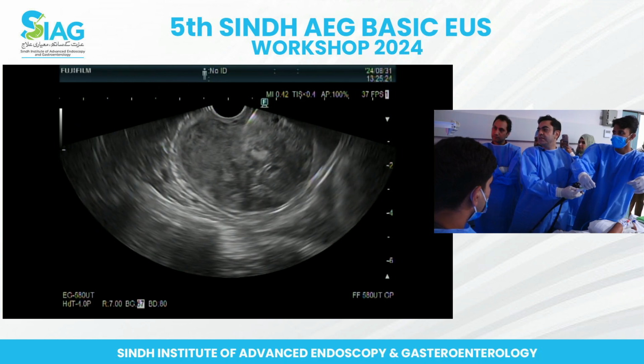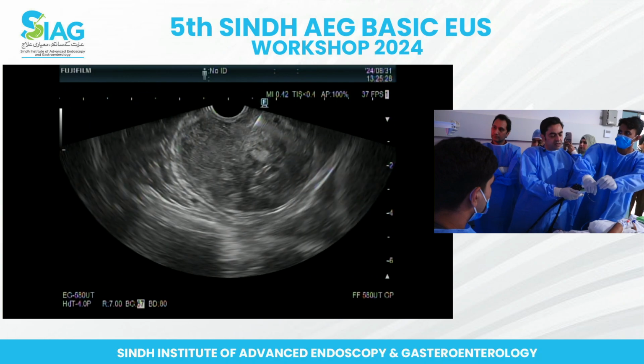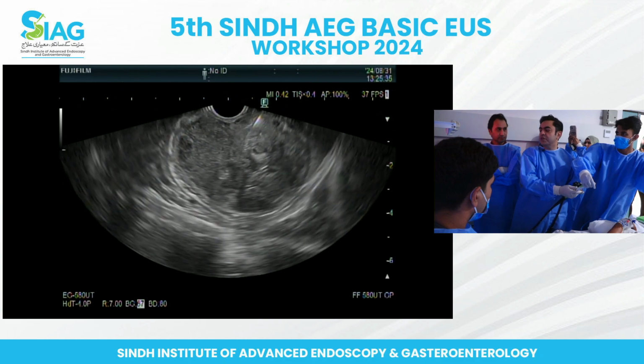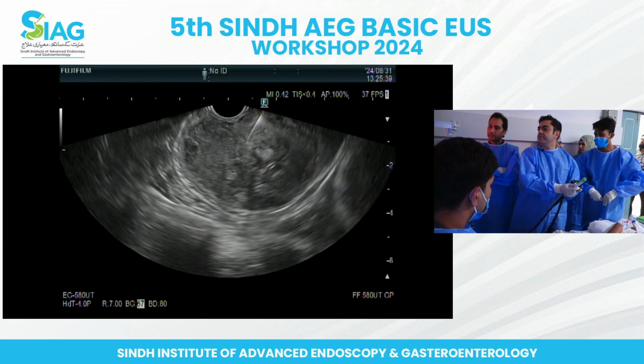Yeah, excellent. And we've got a good sample there, but that's fine. We can take it out. I tend to put a bit of suction as well on top. I understand some people in the group do not put suction. Yeah, take it out. And put the suction on, yeah.